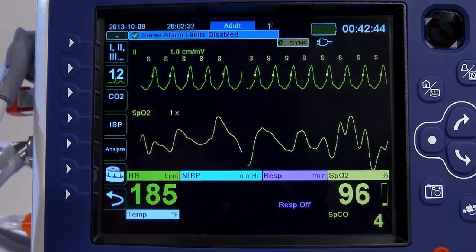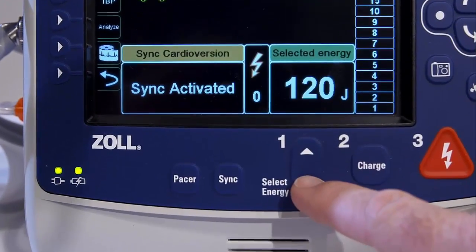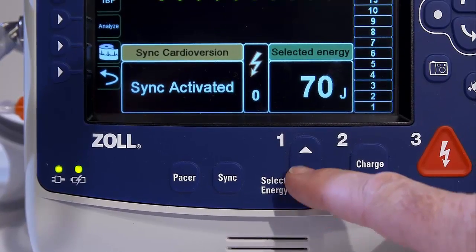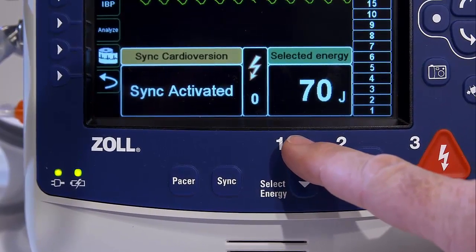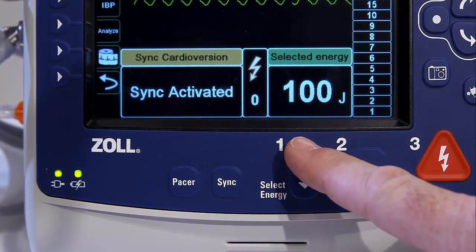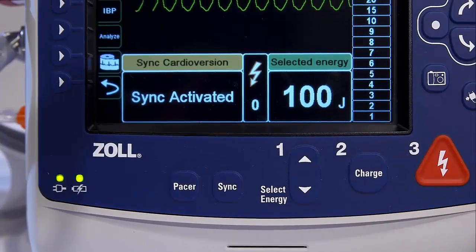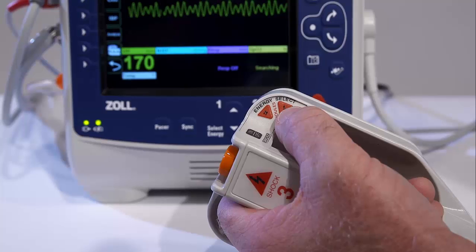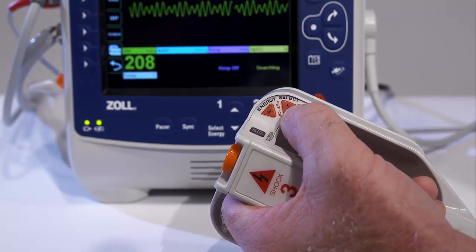Press the Energy Select arrows up or down to select the desired energy level. When used with pediatric pads, defibrillation energies must be set manually based on site-specific institutional protocols for pediatric defibrillation. When using paddles, the Select Energy button is found on the sternum paddle.